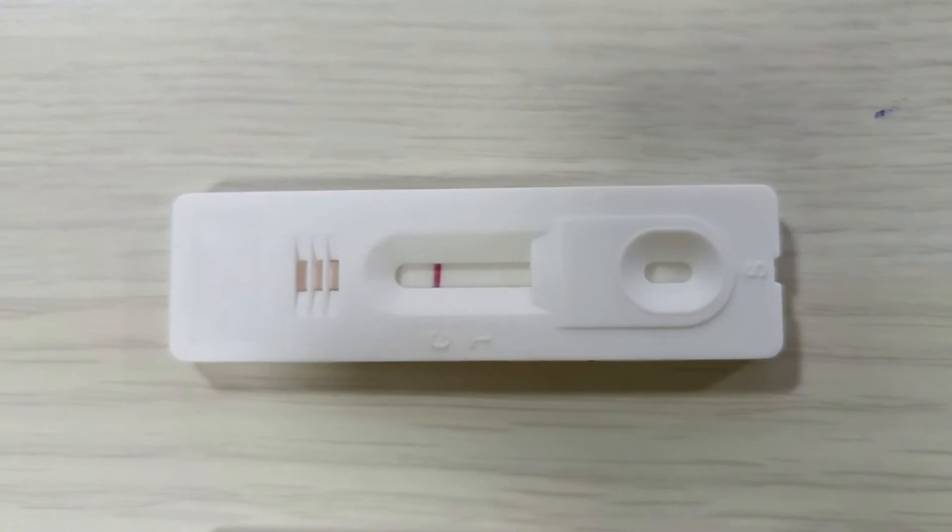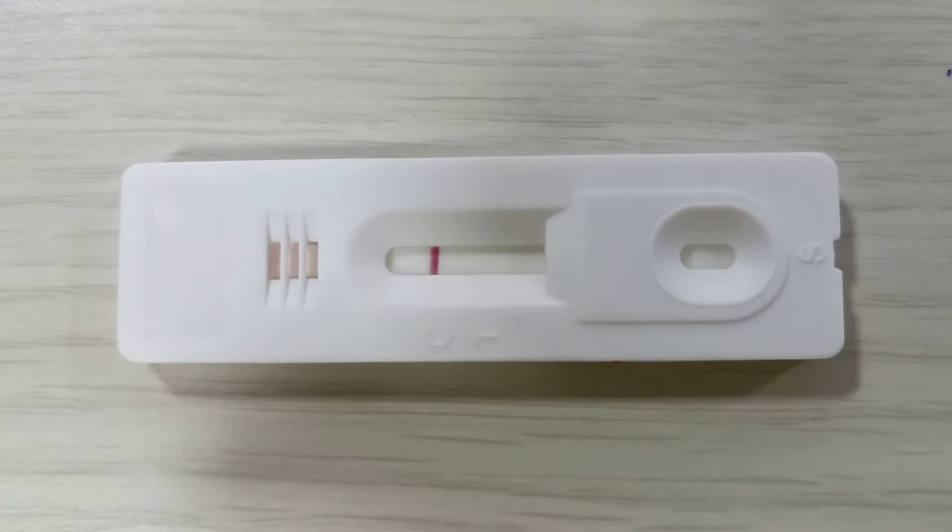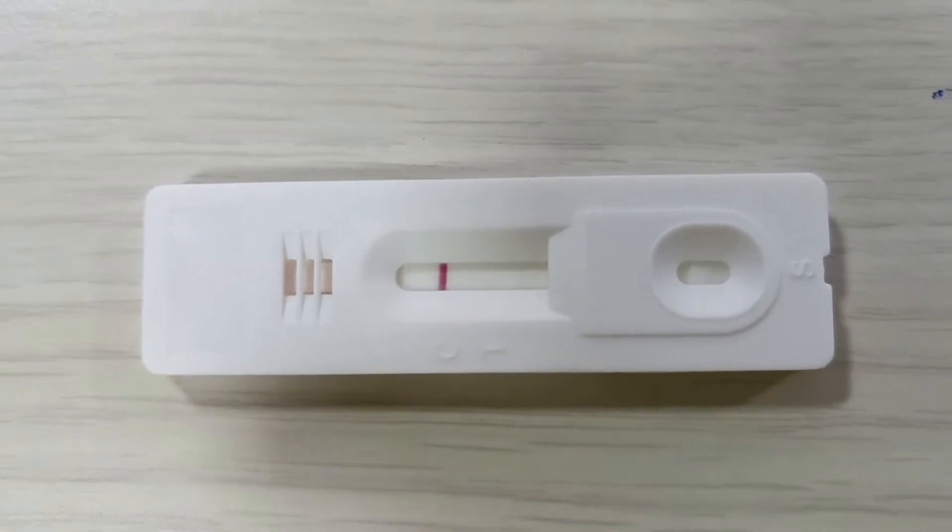A negative result: pink colored line at the position C alone indicates a negative result.